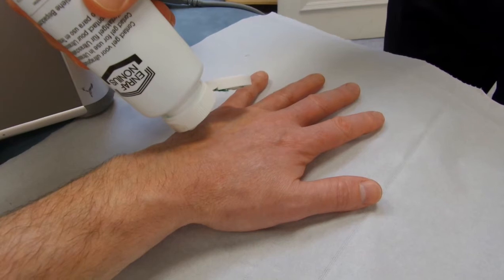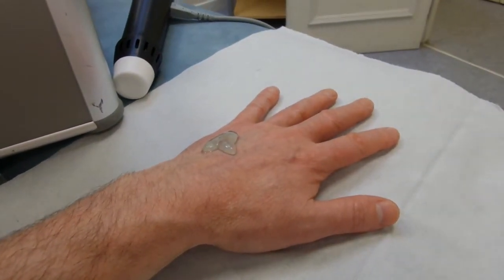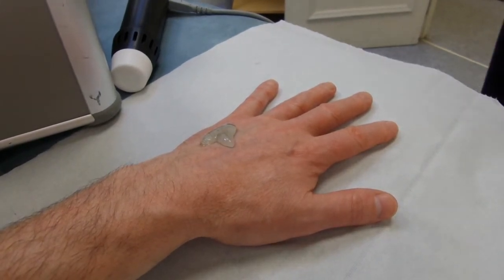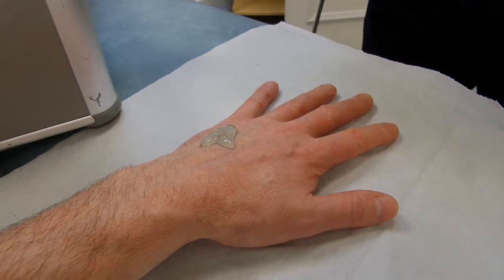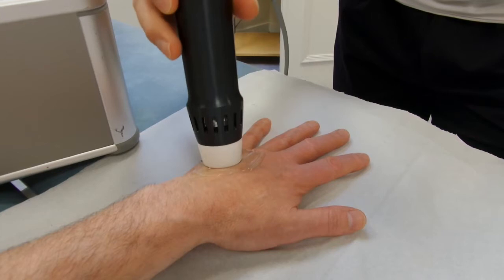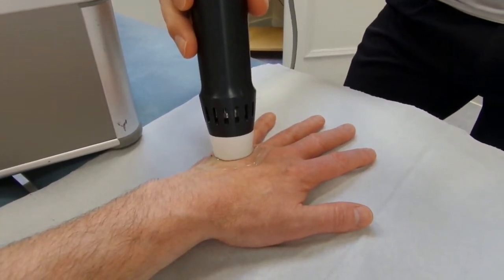Moving on to applying some gel to the hand. You don't actually need gel for this machine. You can do the shockwave with just the supplied oil. Although the gel does help to protect the skin, keeps the heat away from the patient and allows the gel to evaporate a little bit during the treatment.